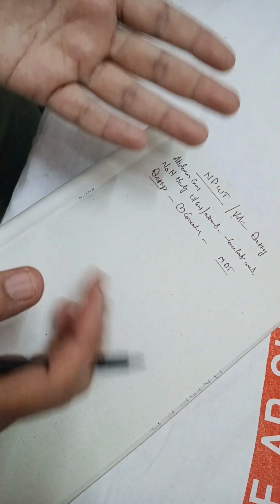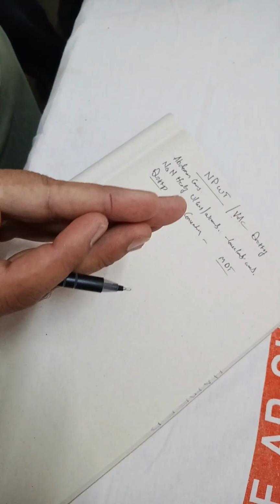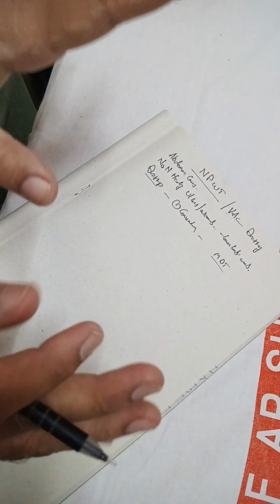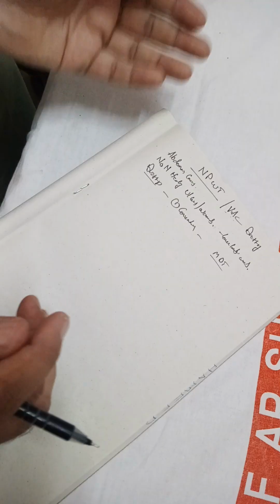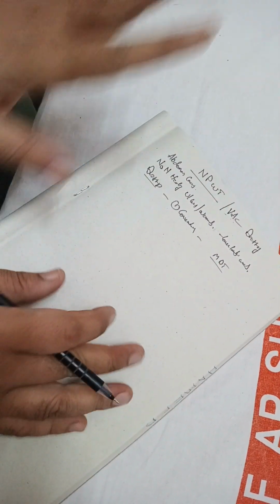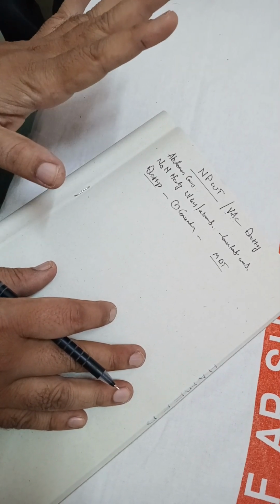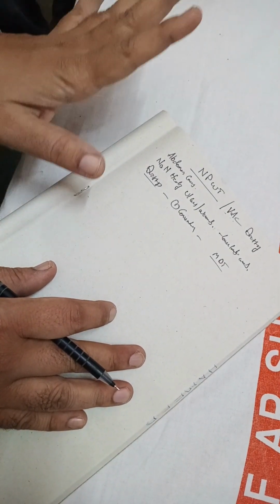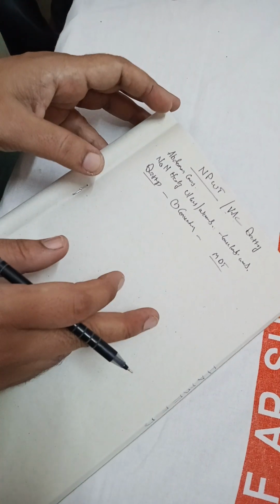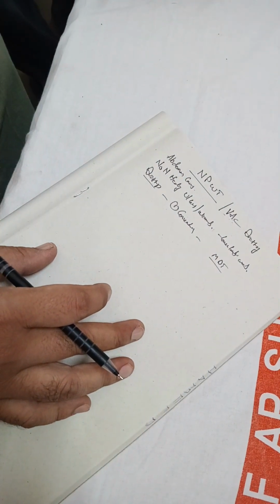Okay, now then only, if the wound is small, we can do a secondary closure. Or if the wound is large, once the granulation has formed, we can take a split skin graft from some other site and put it over the wound. Finally it has to come to the normal anatomical maximum possible state. Okay, so these are different kinds of dressings. So out of that, one of the advanced techniques is NPWT, negative pressure wound therapy.